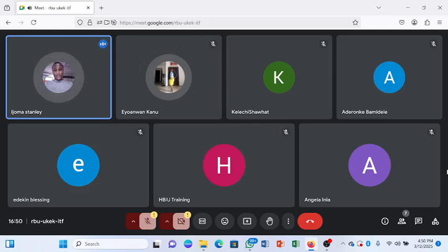Then they have the blue cap. When you see the blue cap, it means that there is an additive used, and that additive is sodium citrate. This sodium citrate prevents coagulation by binding the calcium. It is advised to draw 2 to 3 ml of blood in a tube without additive before transferring it to this tube. So what it's trying to say is that you will draw from another tube without an additive before you transfer it to this tube.